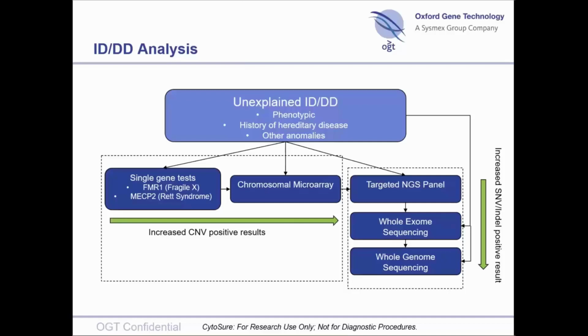The question with the different approaches is the level of information you require for your study, and also how targeted you would like to be. Ethical issues arise using genome sequencing, whole genome sequencing, as you may have variants of unknown significance or benign hits, which require analytical time and declaration as well. So there's lots of different concepts to think about as you select your NGS platform.